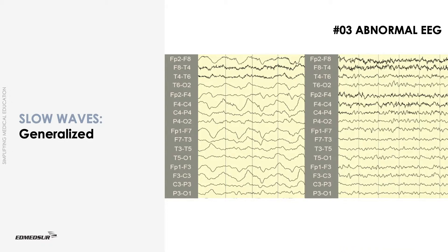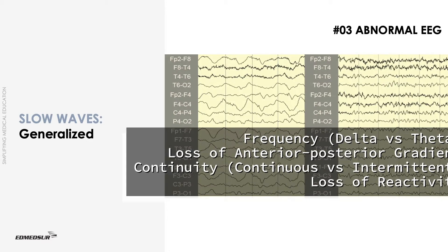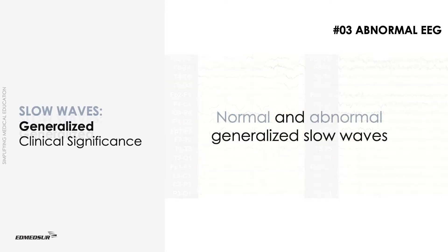Indicators of severity of generalized slow waves include frequency, loss of anterior-posterior gradient, continuity, and loss of reactivity.